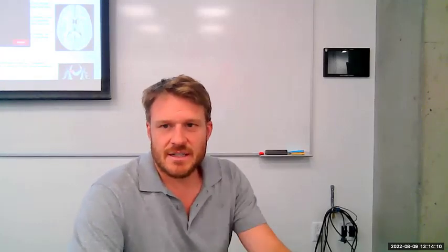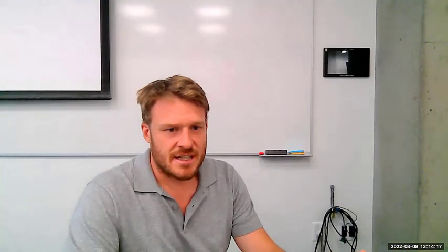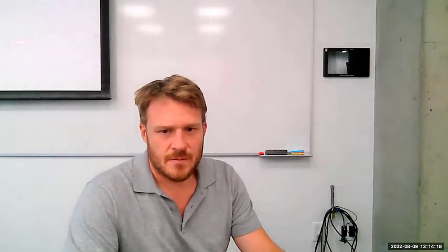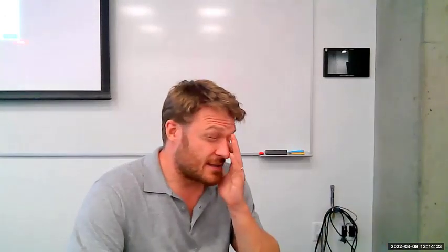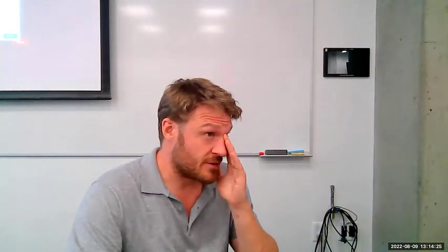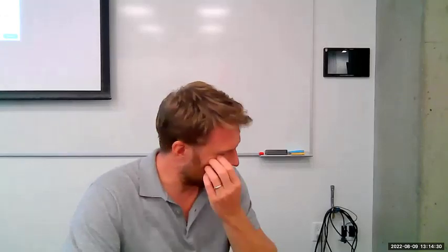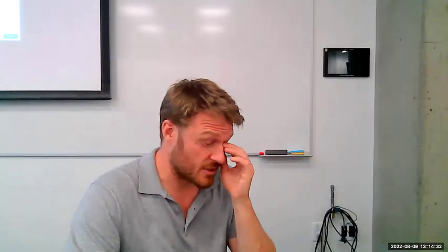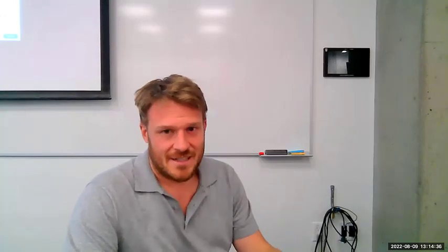I'm going to share the screen this time. I think that's not a naive question. I think that's an excellent question. It all really depends, again, on the age, because pretty much from birth to 6 months, it'll look good on T2, but around 6 months, there's almost no tissue contrast in any of the things you use. So it can get quite tricky.